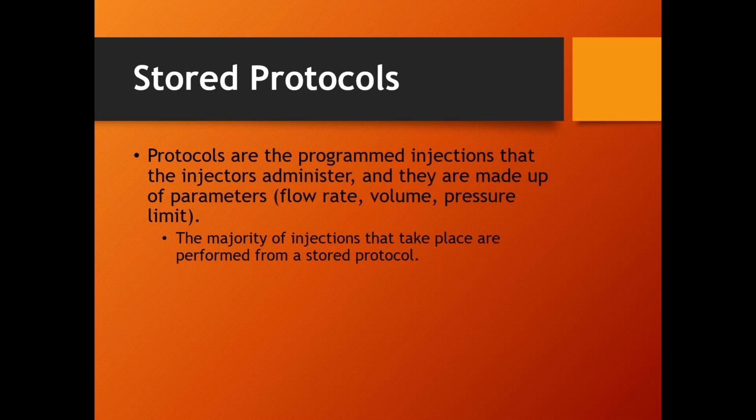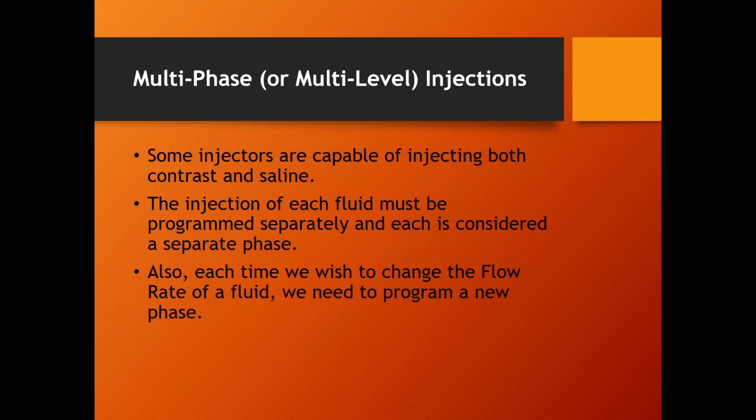Typically, they don't sit there when the patient comes in for, you know, an AP chest, anterior, posterior chest through the front, out the back, and say, well, let's do this flow rate. No, they have an AP protocol. They just go in memory, click one button, and it brings up the entire protocol. They typically stick to those library protocols. I'll deviate a little bit sometimes for the size of the patient, but they rarely enter the protocol for each patient manually.